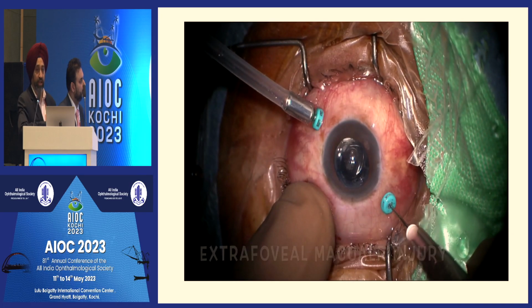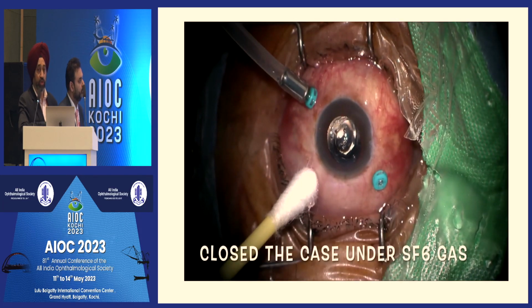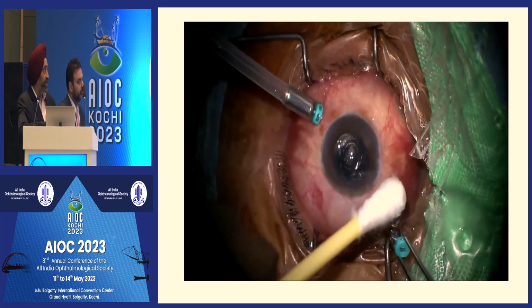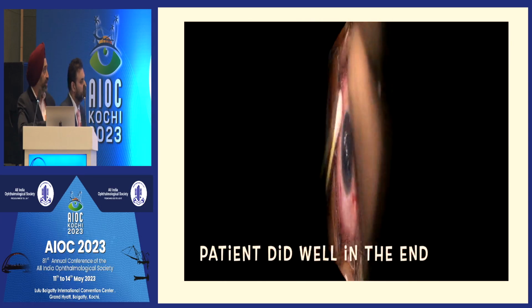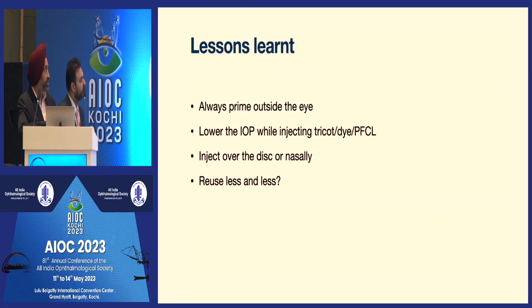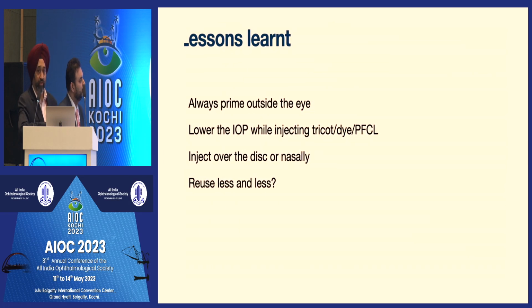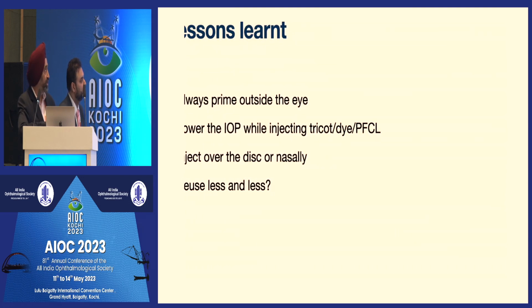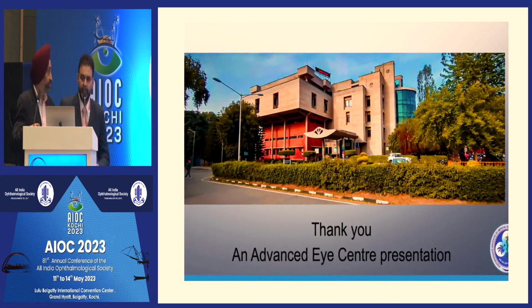But this taught me to always prime the instruments outside and always use new instruments. If you reuse them, these incidents can happen because the green tips can get plugged with debris and be pushed into the eye. And the patients, if you follow the rules and do the basic things and don't mess up, are generally very forgiving, and God takes care of everything. This is my case about this iatrogenic injury with the ILM.